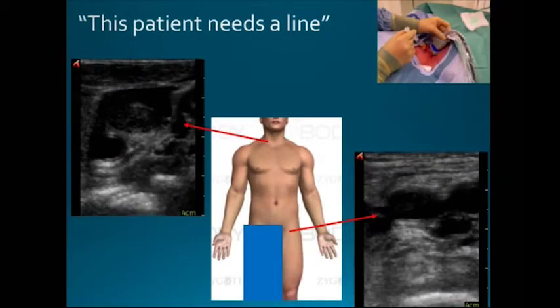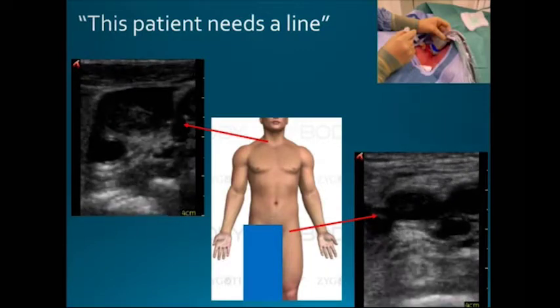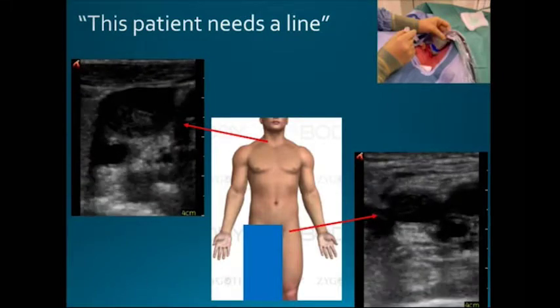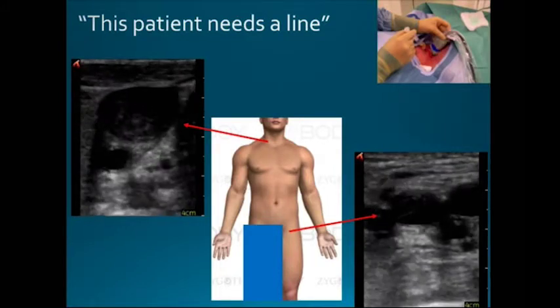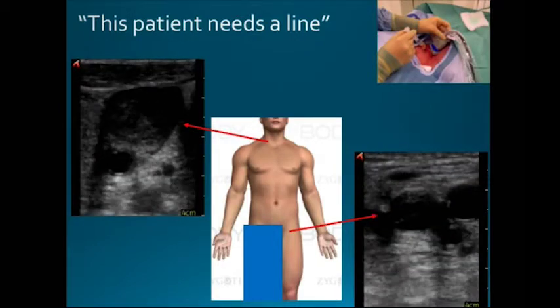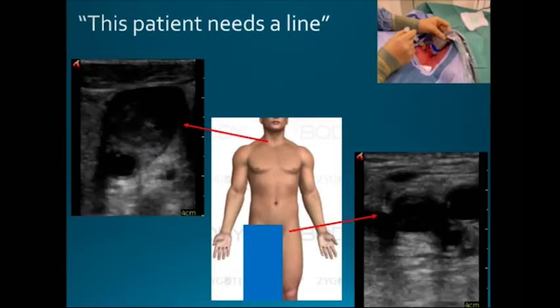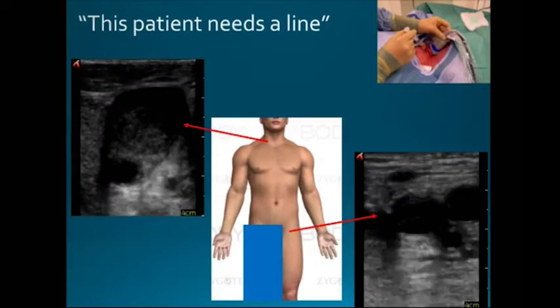And you say, oh wow, this is not a good place to be putting in a central line. Let's come down to the femoral vein and see if we can put in a femoral line. Lo and behold, she has the same process going on here. She was essentially developing thromboses throughout her whole body. We thought, oh my gosh, what's happening here? We recognized early somebody with severe sepsis. She actually had DIC, and we got all the panels and recognized her with DIC, appropriately triaged her to the right level of care, and then found an open vessel to cannulate and get her access.